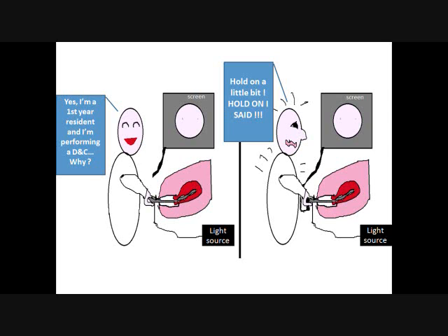Just bring it back to its true proportion by dragging your attention to all the intrauterine procedures that you usually perform without any particular anxiety, even if they're blindly done. Plus, if you're a gynecologist, you do know that there are risks in every procedure in medicine, including hysteroscopy. But thinking of hysteroscopy as being more complicated than a blindly performed DNC, for example, I just doubt it. And just for your information, diagnostic and office hysteroscopy are nowadays considered routine procedures.